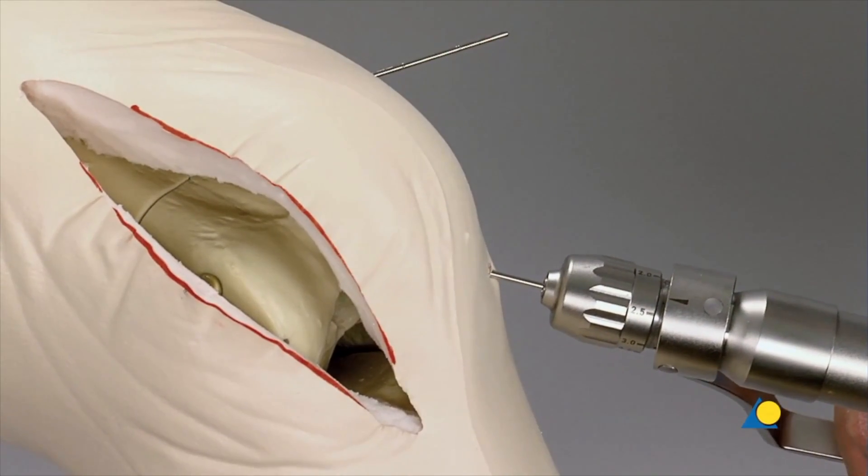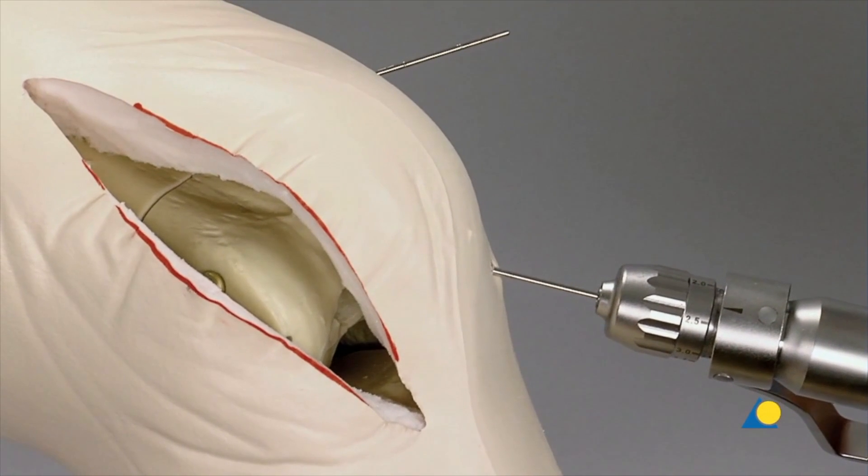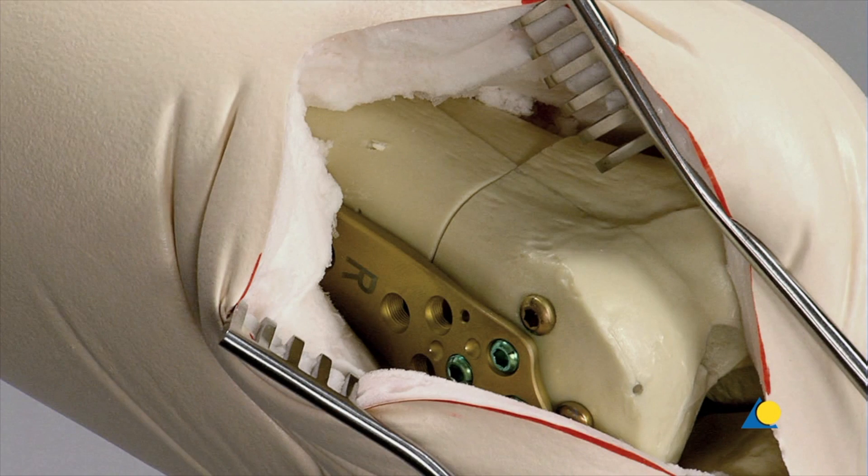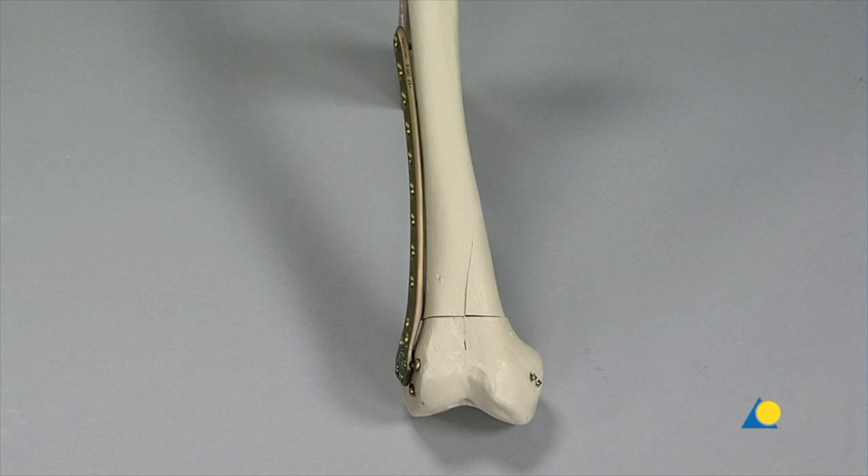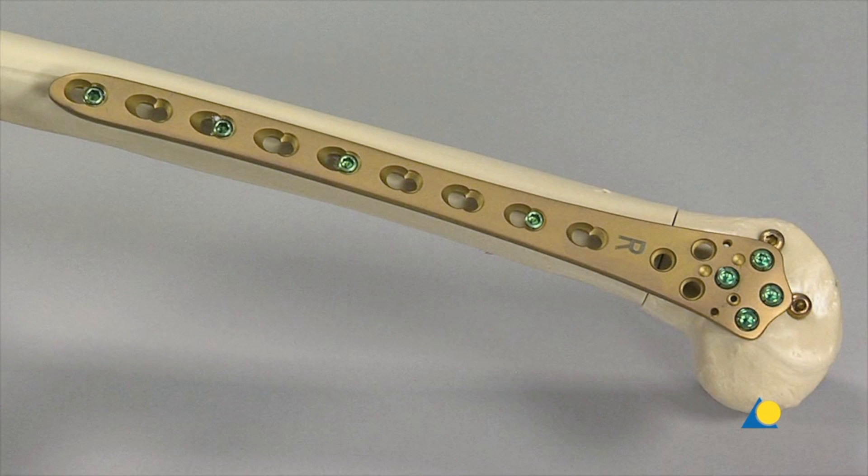The two remaining K wires are removed. It can be seen that the fracture is well reduced and that the plate is correctly placed on the bone. Depending on the length of the femoral shaft fragment, another screw can be inserted.